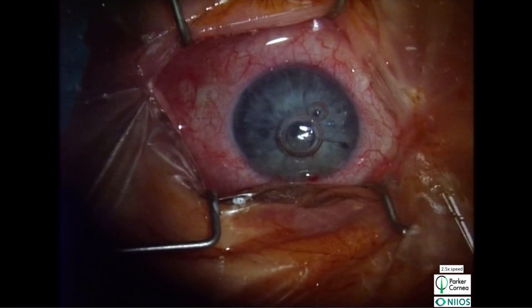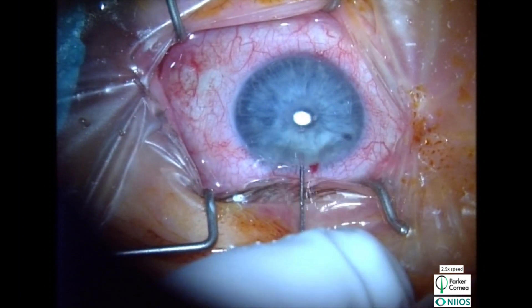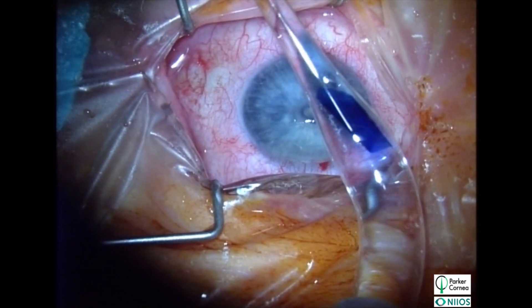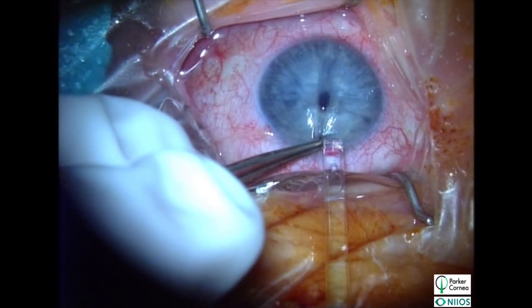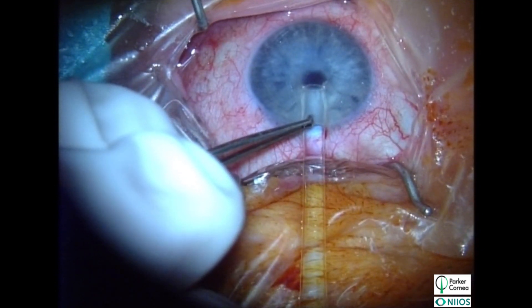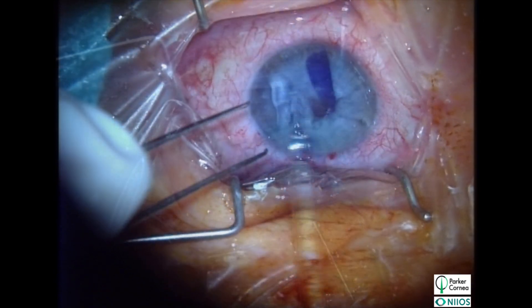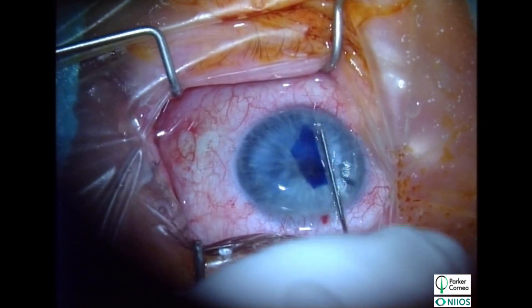Just before graft insertion, a fluid-air exchange is performed and the anterior chamber is shallowed. The graft is slowly injected, being careful not to over-pressurize the anterior chamber. The AC is again shallowed to prepare for graft unfolding.